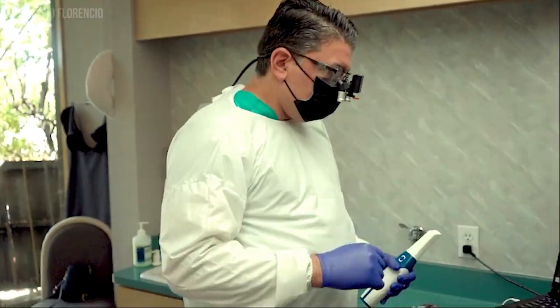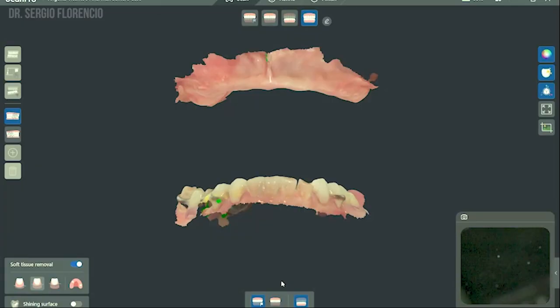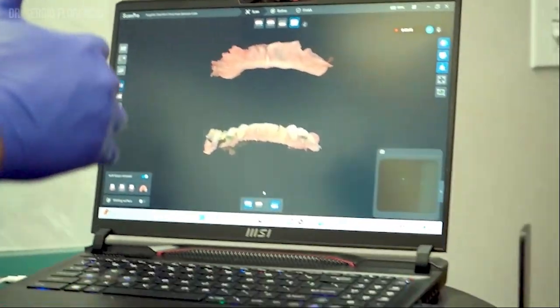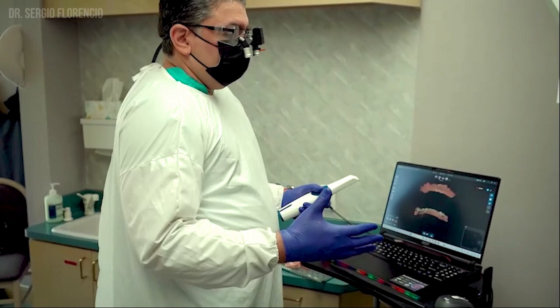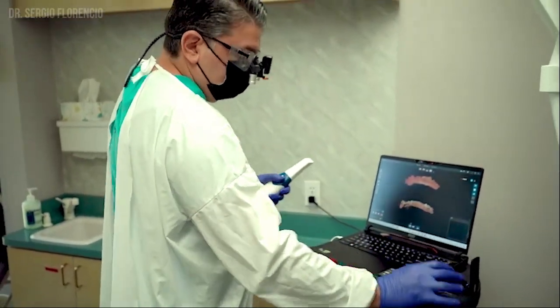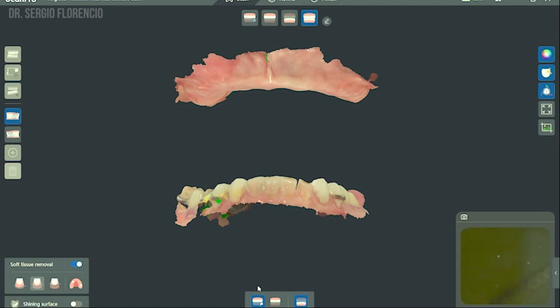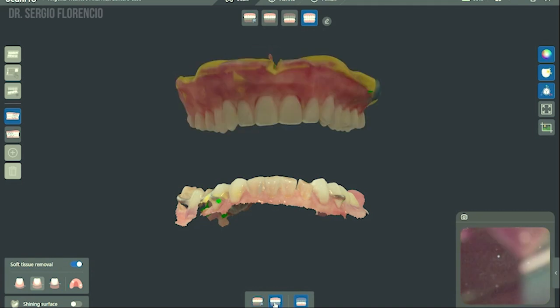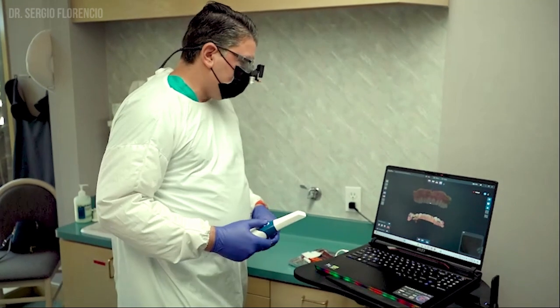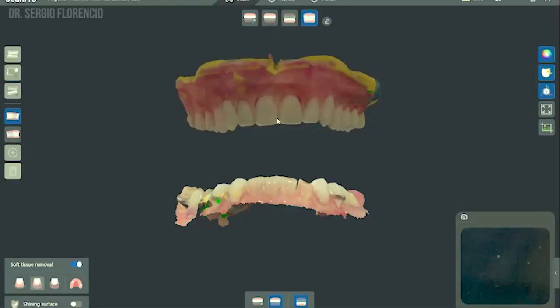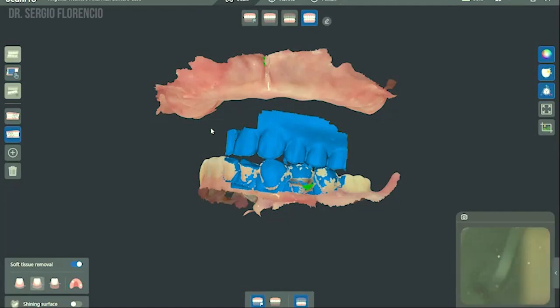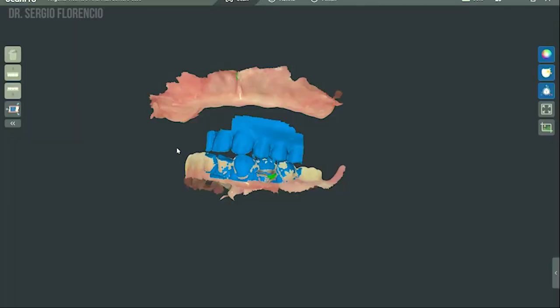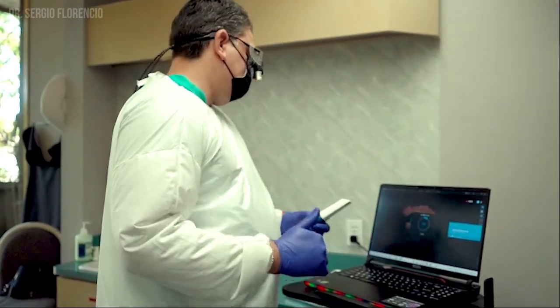Now here's where the problem comes in. Taking the bite with the scan as-is will not work because when we scanned the denture we should have had a step to flip the impression and flip the normals so the teeth are not inside out. There's also a problem with bite capture: you have the pre-op and final available for selection, but the software keeps switching back automatically, so I can't take the bite regardless. If I try to take the bite openly with the denture in place, it captures something but we can't stitch these together — there's no way to mount this without doing the other steps.